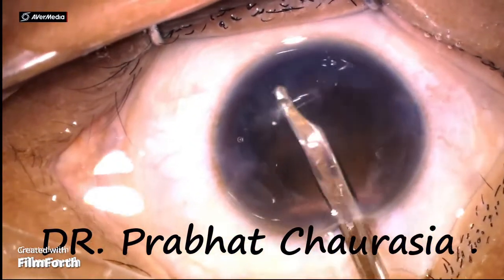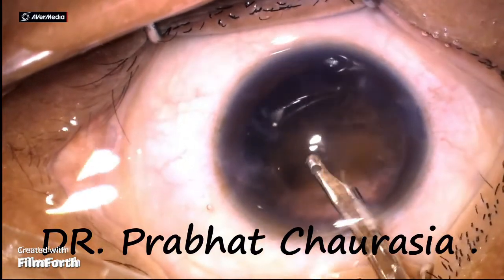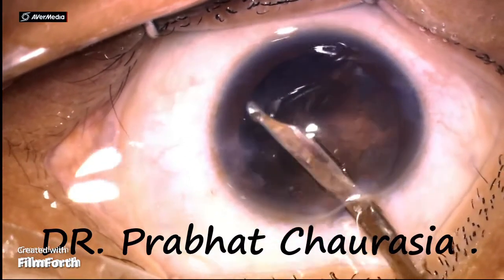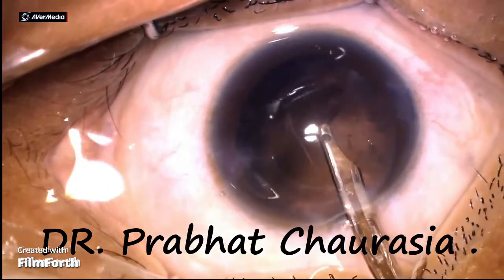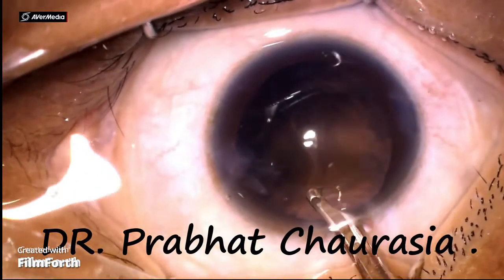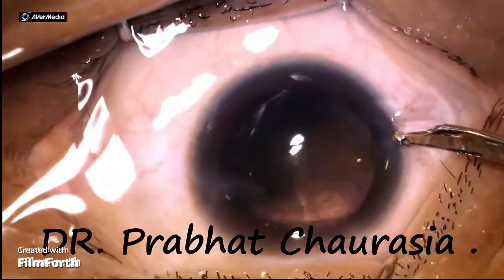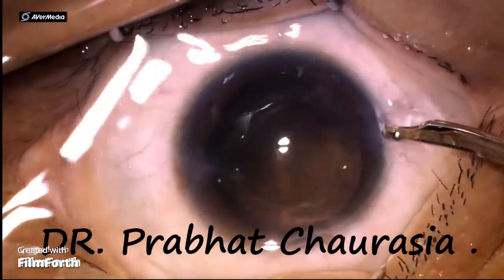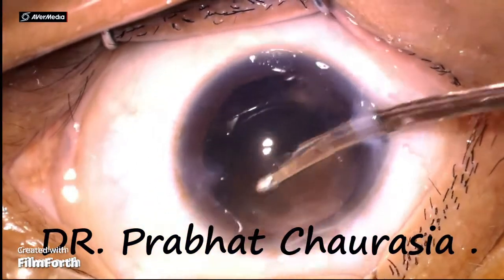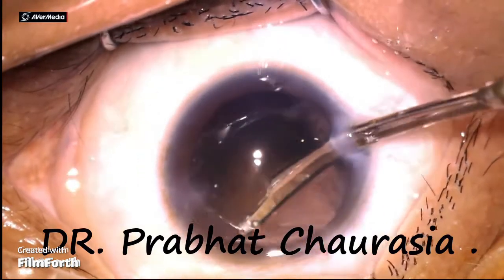My dear friends, while doing this manual aspiration, always keep one point in mind: never face the aspiration port towards the posterior capsule — never, never, and never. Sub-incisional cortex can be removed by going through the right-sided side port.